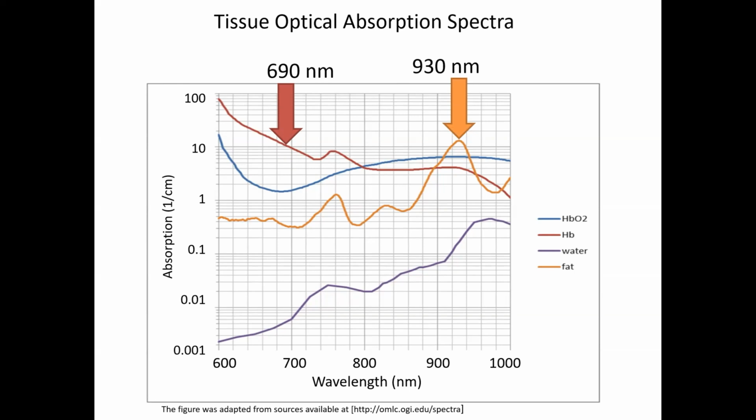So by narrow band illumination of the tissue sample, you can excite particular chromophores, and assuming that the tumor mass has different optical properties from the surrounding tissues, you can then reconstruct a contrasting image visualizing the actual tumor lesion.